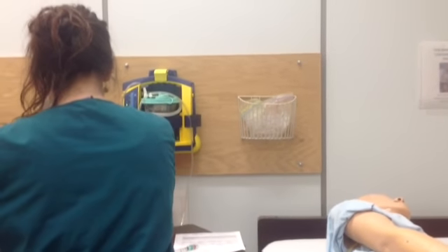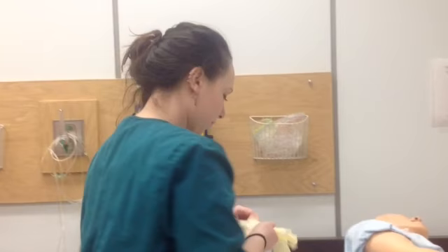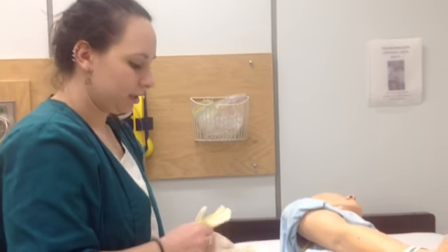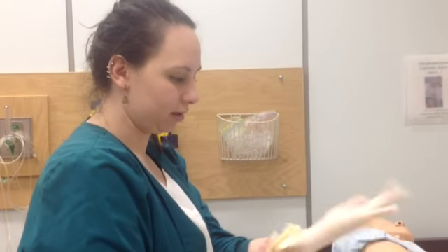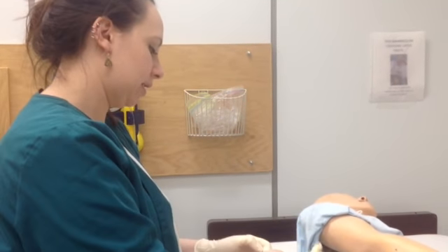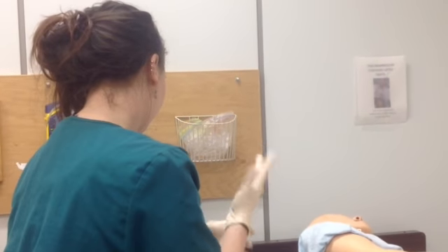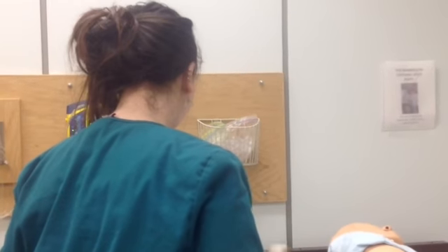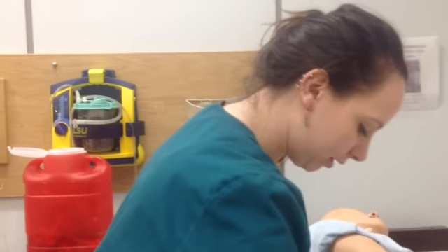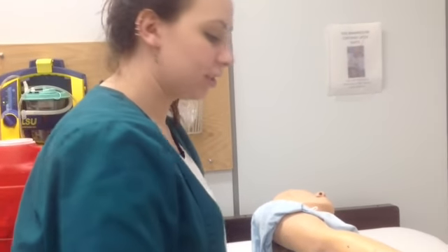So I'm going to put gloves on. I'm going to put the needle on the bed. The safety cap is still on. This is going to help me keep it in front of me. I left it behind me to show me where to put the shot.